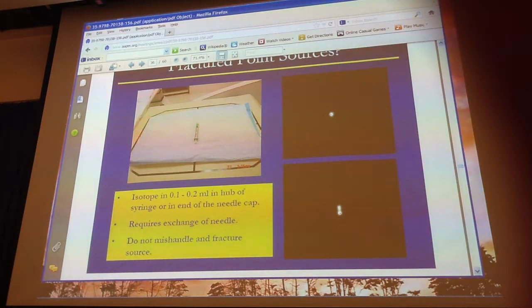Well, we're assuming that this technologist who did this flood source was very concerned about contamination, so they have a polyvinyl towel or a chuck protecting the collimator. So we're going to assume that it's not the flood, or that it's not the source. But what does it mean when you see 2 dots when there's only one source?